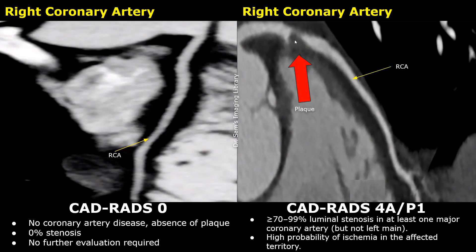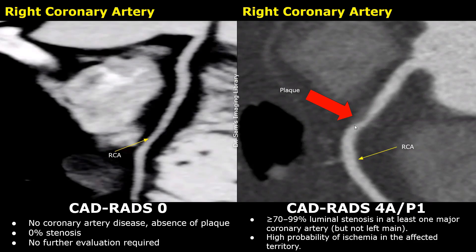Here is another case showing a CADRADS-4 lesion — a low-density plaque in the right coronary artery causing severe stenosis, which seems to be between 70 and 99%. A very small area is unobstructed, and the artery enhances normally distal to the plaque. So this is not an occlusion. Plaque burden is P1 because only one segment contains a plaque. This plaque is also causing severe stenosis, falling into the CADRADS-4 category.